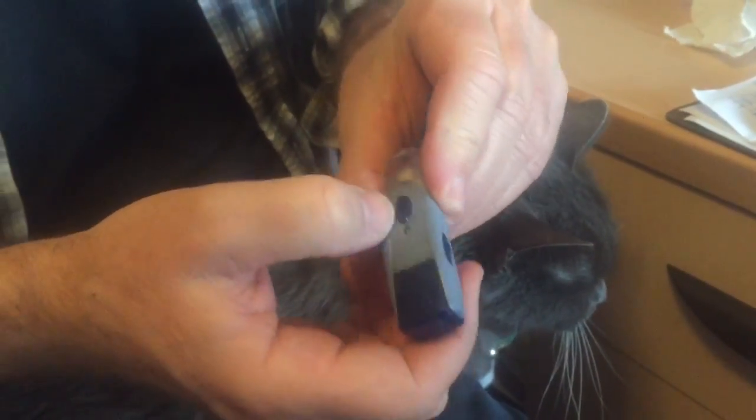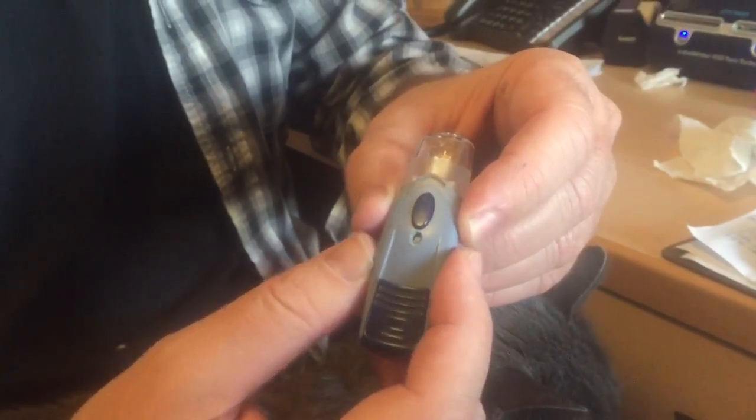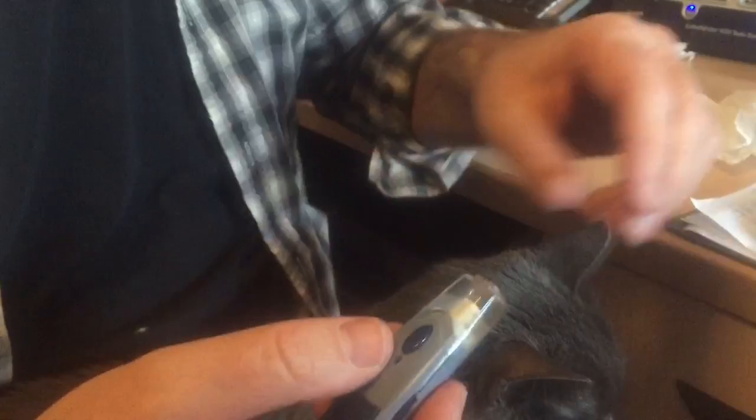Usually you can leave it on. There's a number dialed right here — usually I find two is the best, sometimes three. You don't have to go over that. That's just how hard it needs to be poked.